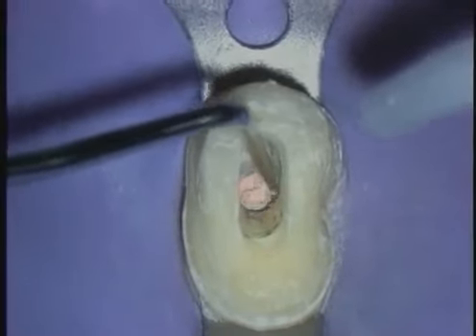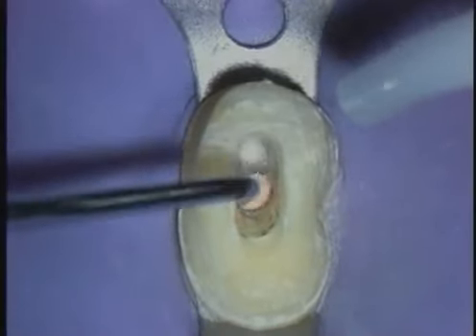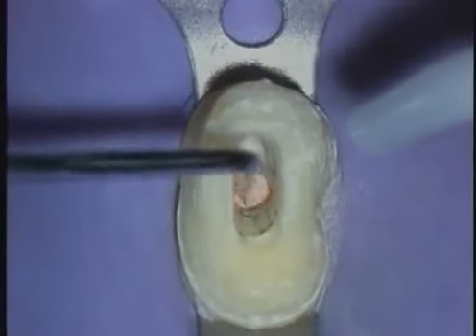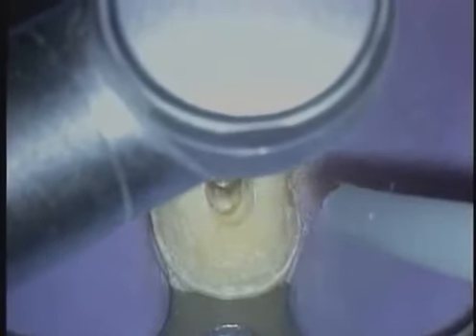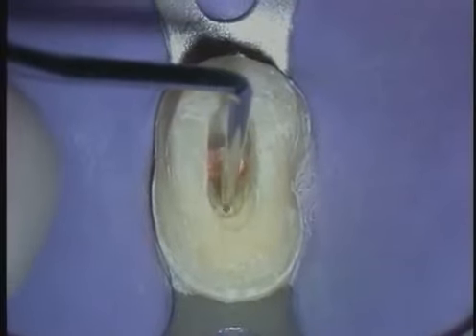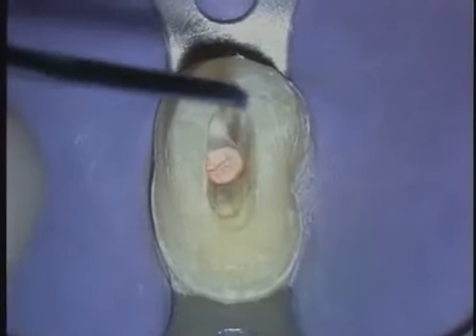Here the explorer can chip away and start cleaning up the axial walls so we have a good line of sight, and we can begin to look at the gutta percha and see where it's positioned between the facial and lingual walls. In that particular view, it almost looked like it was centered, but because of our confidence with our radiographic examination, we know to chase and look for the missed canal. We even know from our preoperative radiographs that the missed canal should be lingual.